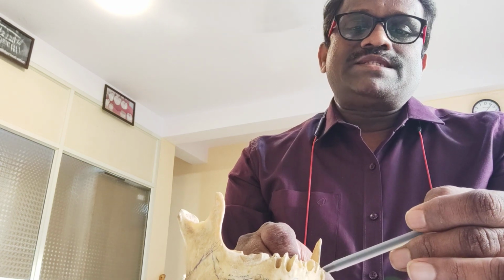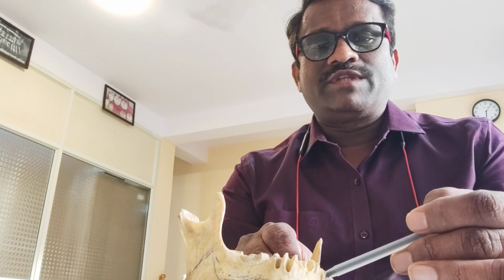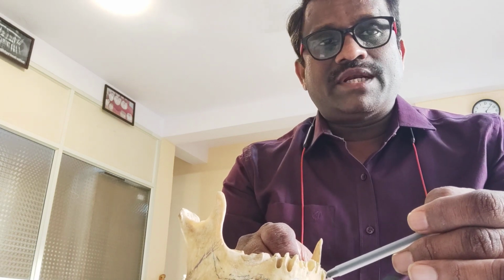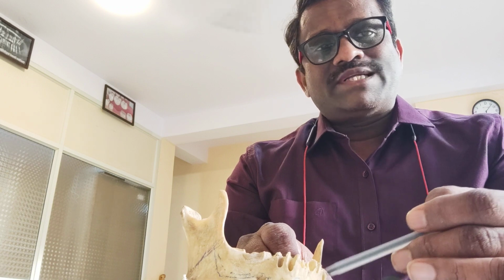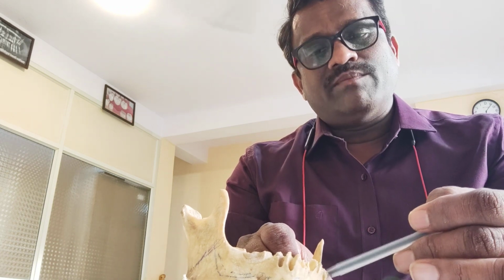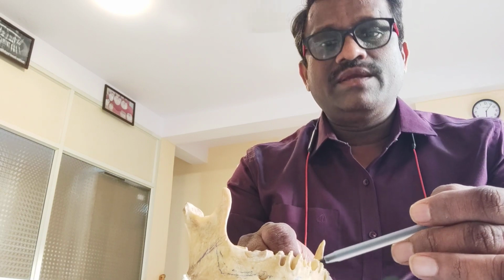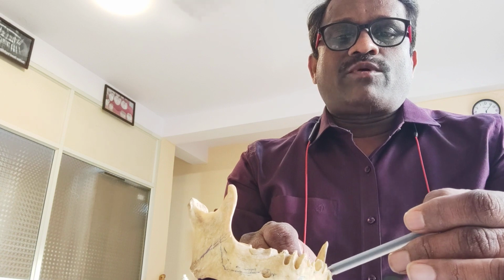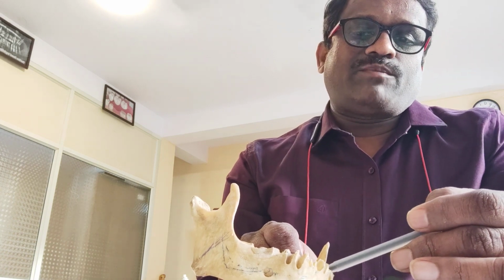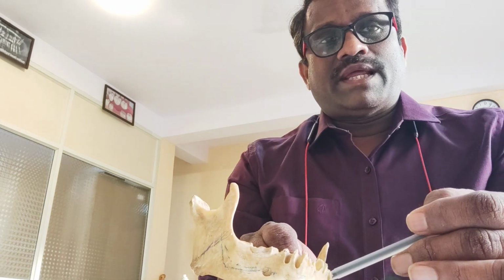The advantage of single piece implants in the bypass technique is that the implant material, titanium grade 5, and the diameter of the KOC used here, 3.6, 4.1 or 4.2 mm, allow us to bend the implant abutment. We can bend the head of the implant to the proper occlusion and prosthetic arrangements.